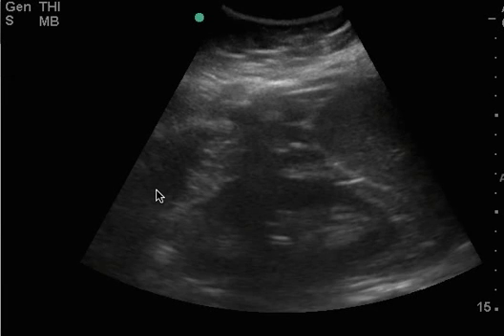This is a video of both FAST feedback and OB feedback. First, this is a FAST exam where mostly there were stills. I want to focus on this because you have your spleen over here and you have your kidney, and you have your indicator over here.